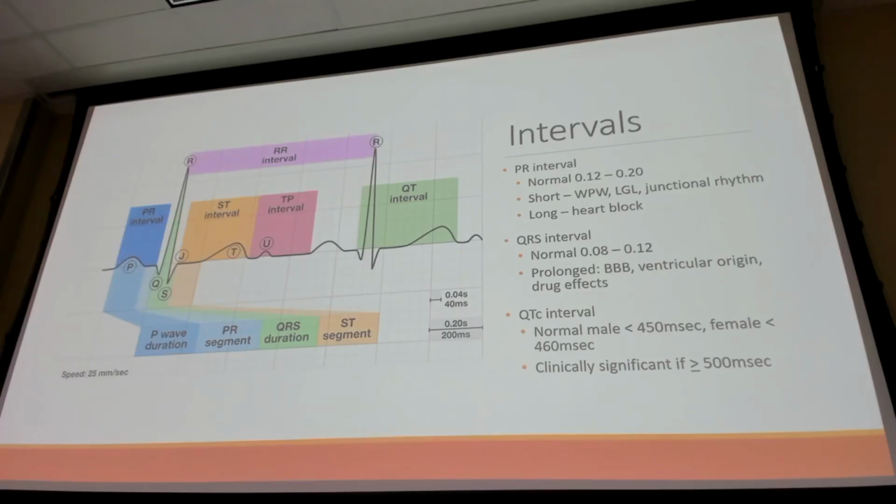You'll be doing a lot of physical exams, especially like a special forces physical, and it'll say 0.11, incomplete right bundle branch block, and they'll want you to send them to cardiology. It's a real big waste of time because it's a normal variant that you see very commonly. So it's something to think about, whether you really have to refer them and waste the cardiologist's time.